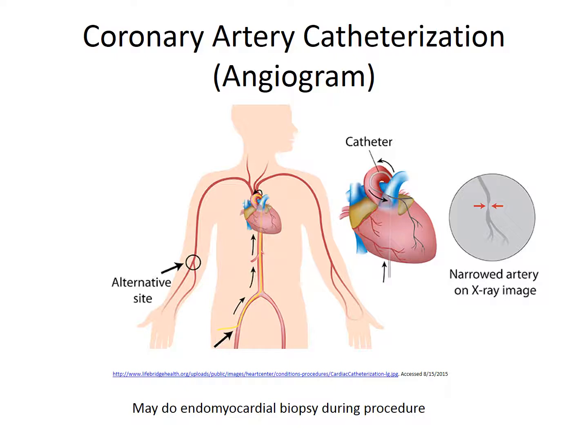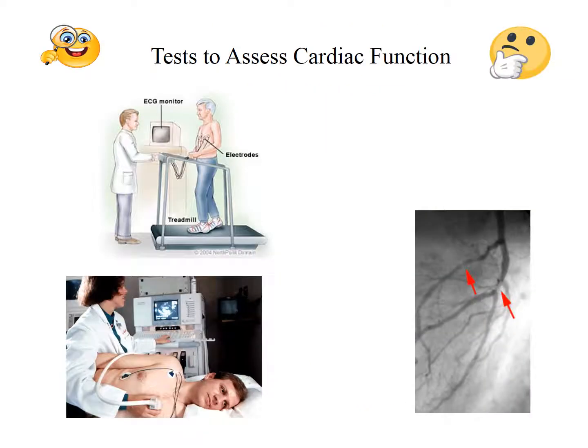Here is a schematic showing the coronary artery catheterization procedure. This test is also called an angiogram. In this presentation, we have discussed several diagnostic testing procedures to assess cardiac function. You should be familiar with the names of the tests and their primary uses.